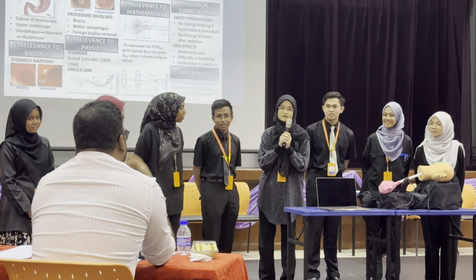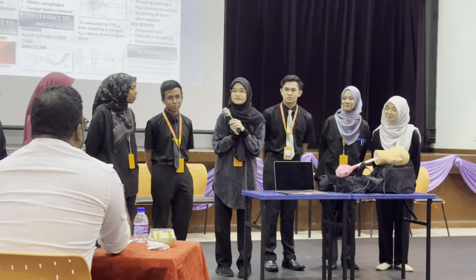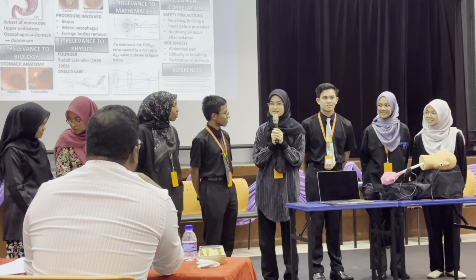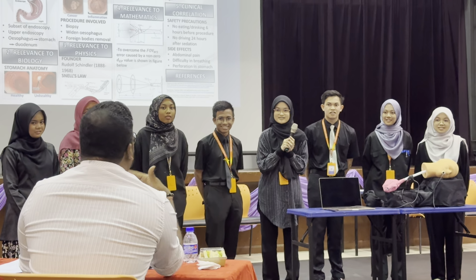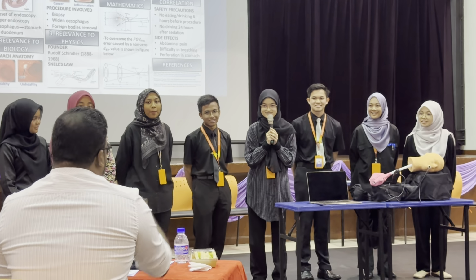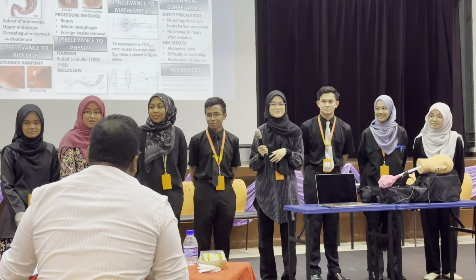Supine, prone, lateral. What do you call the position? Just now you said this is lateral. Maybe on the left side. Left lateral. He is giving answers. Left lateral. Okay, thank you.